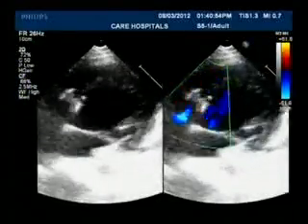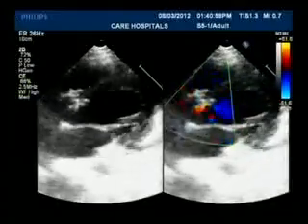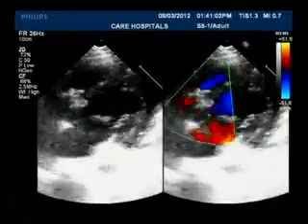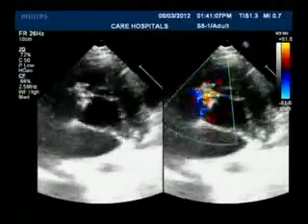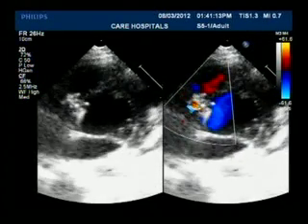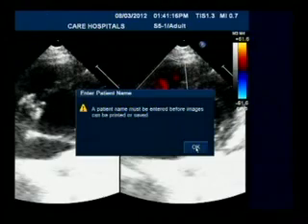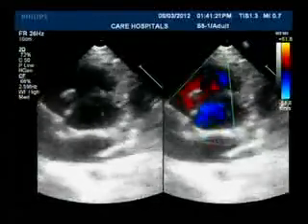Yeah. So it looks like the shunt is abolished. There is some aortic regurgitation you can see. That is very important to understand. It is a catheter-related aortic regurgitation. If you have a very thin retroaortic rim, it is going to be problematic to assess. So it's better to document that before you release, and make sure whether it is catheter-related aortic regurgitation versus actual entrapment of the aortic valve.